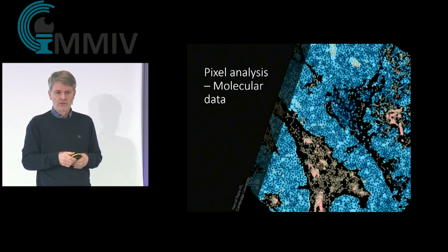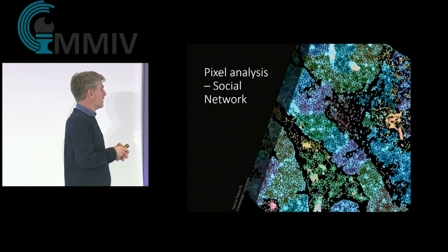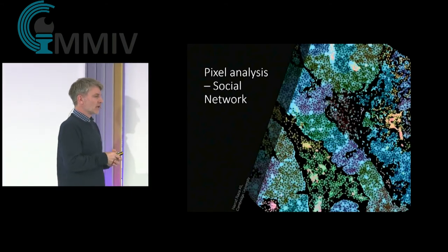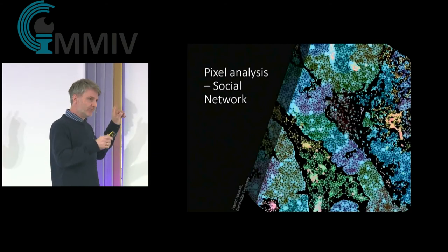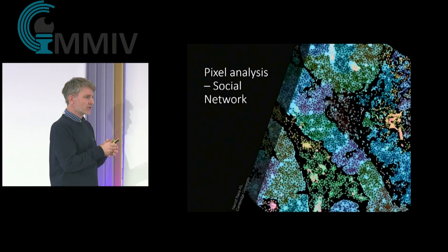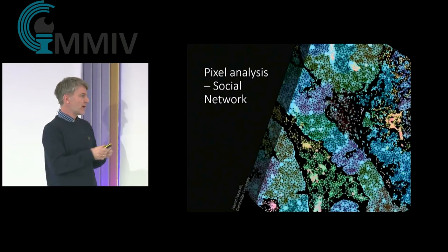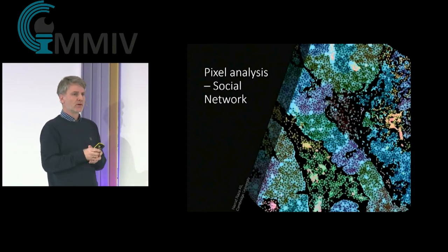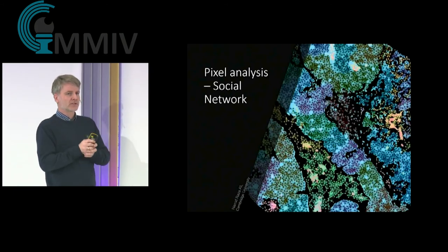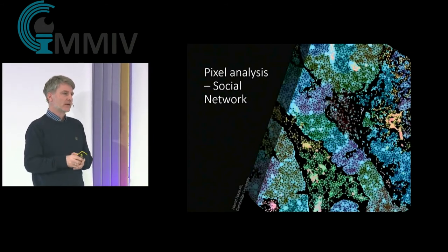And in the end, you can also look at the social network, looking at great parts of the tumor or the immune cells in different patient material that you have. And this is actually a snapshot from the patient, because it's taken right out of the patient, it is preserved, and then you can look at it. For many other models, when you look at molecule data, you will extract the tumor, make it into single cells, you will mush it maybe into a protein soup, or whatever you would call it, and then look at different molecules, DNA, RNA. But now you can look at it in real time from that snapshot of the time.